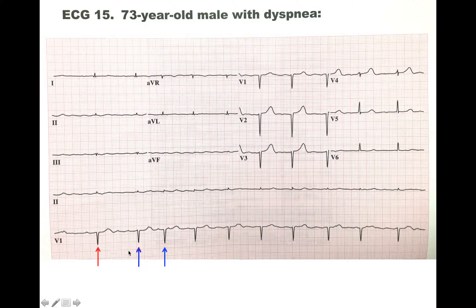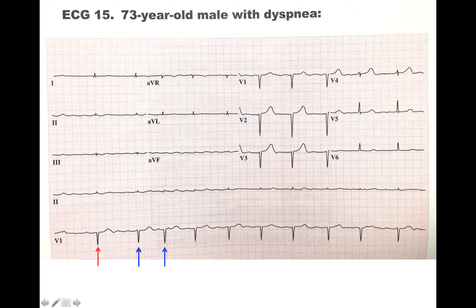Another thing to notice is that each ventricular contraction is occurring at irregular beats — this distance is longer than this distance, and it elongates a little more again. So we can say this is an irregular-irregular beat, and therefore we can classify this as atrial fibrillation. There is overall low voltage because the atria is fibrillating and the ventricles are trying to contract but it is not a regular rhythm.